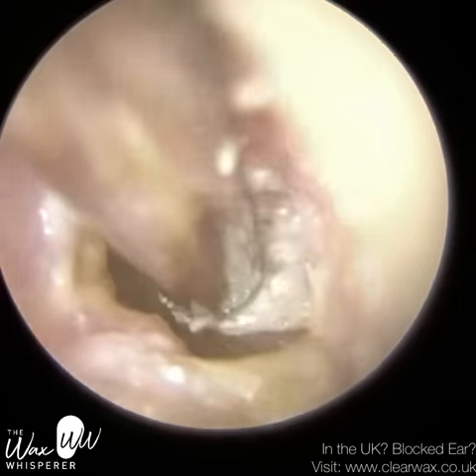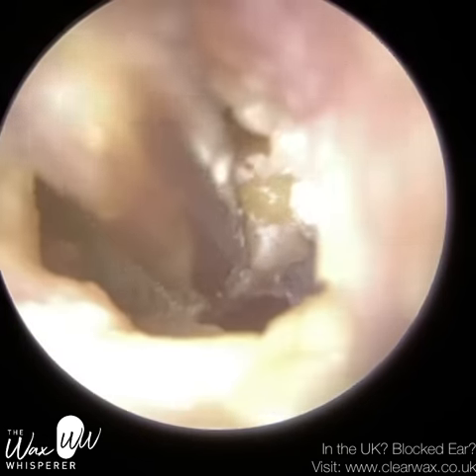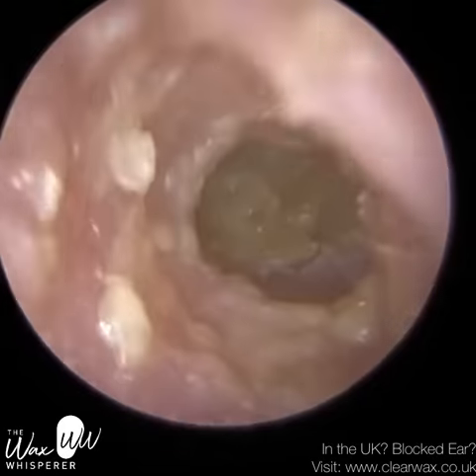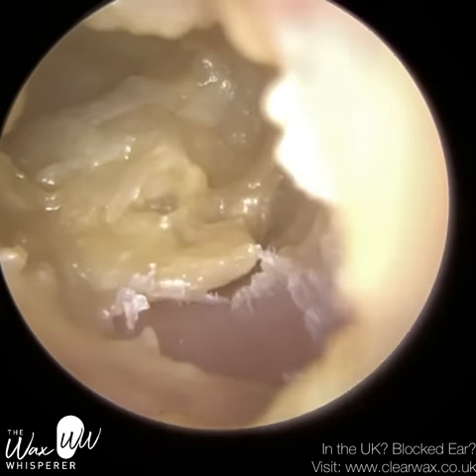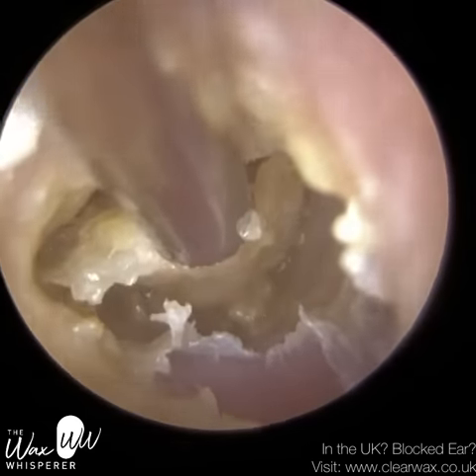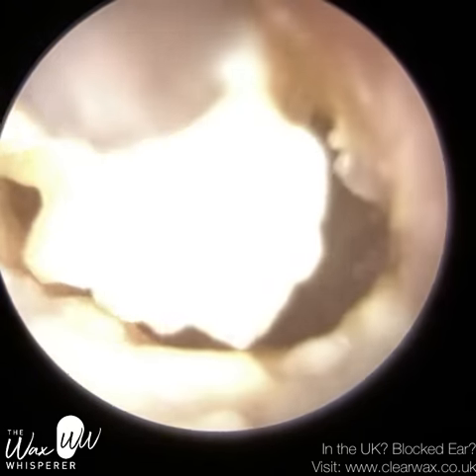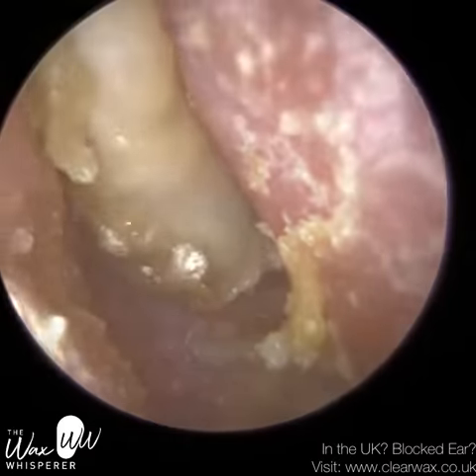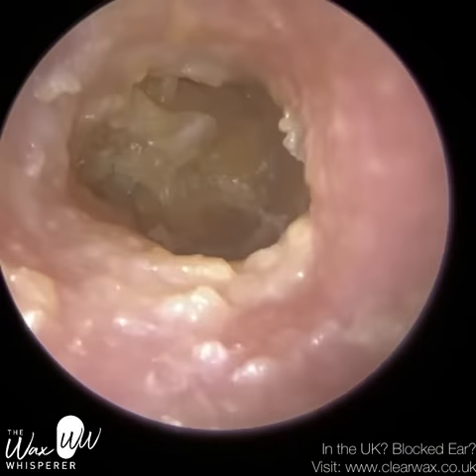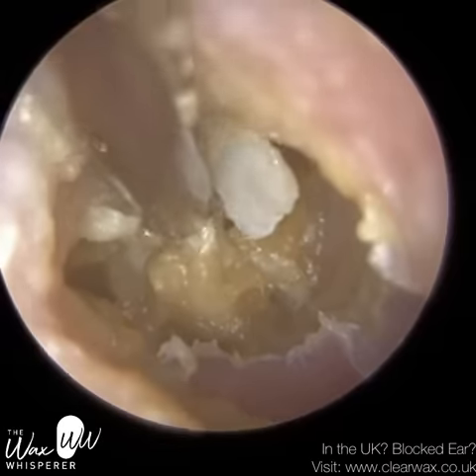The main challenges we have — three main challenges — is that first of all, the patient's ear is already uncomfortable; it's tender because of the infection, so we have to be extra cautious. Secondly, the mid-canal section where it's really swollen can on occasions collapse. That can happen if you've got an infection and edema — a buildup of fluid in the cells. When you perform suction, the water in the cells gets attracted by the sucker, inadvertently causing the canal to collapse. On several occasions I had to immediately evacuate the ear, and it can be really uncomfortable for the patient. You'll probably see that more in their right ear, but it did happen here on a few occasions.